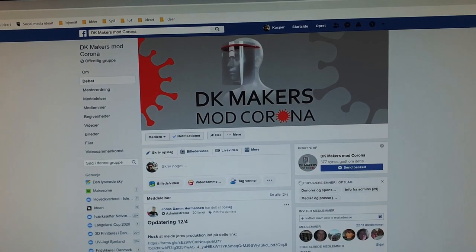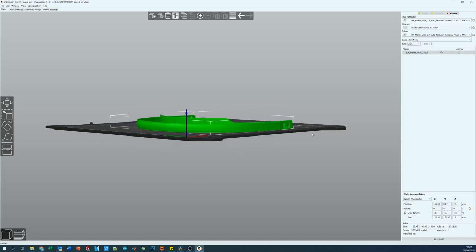In Denmark all the makers have banded together into a group called DK Makers Against Corona. Basically what the group does is they organize the production of personal protection equipment for the healthcare system done by makers. They've managed to take a Spanish design for a protective shield and together with the Danish authorities managed to make it actually be approved for use in the hospitals.